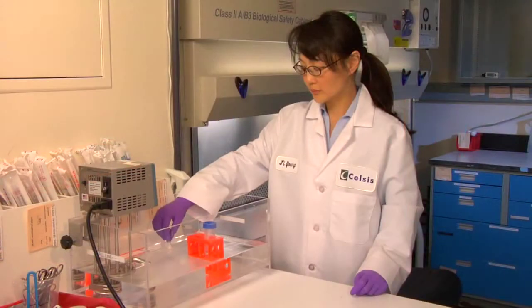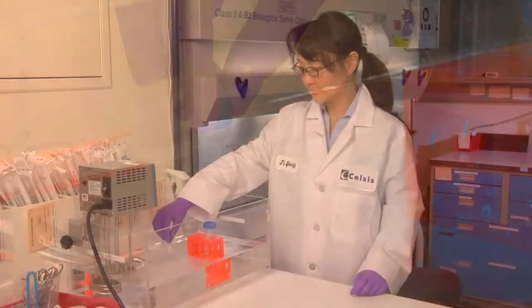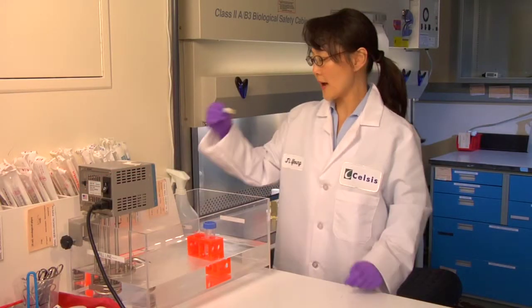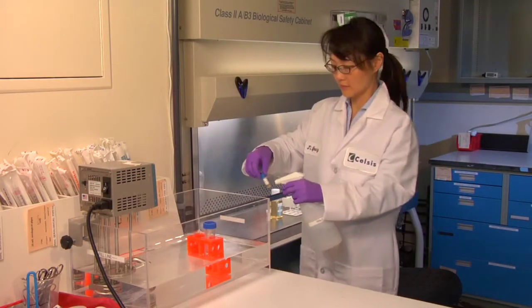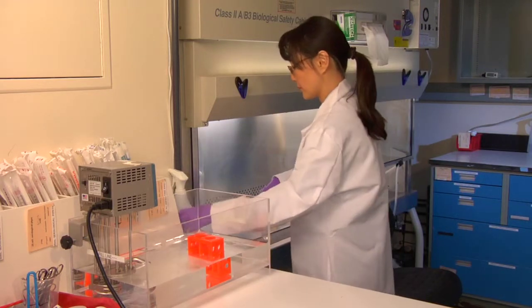After about one minute, invert the vial to see if it has begun to thaw. If not, return to bath. Wait a few seconds and invert again. Once the ice pellet releases from the vial wall, the cells are ready to be poured into the pre-warmed InVitroGRO CP medium.